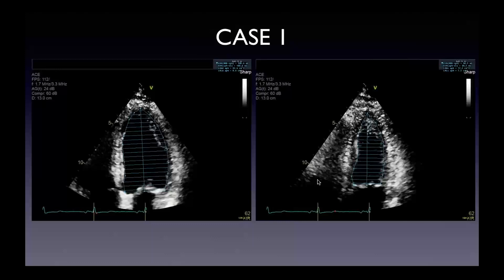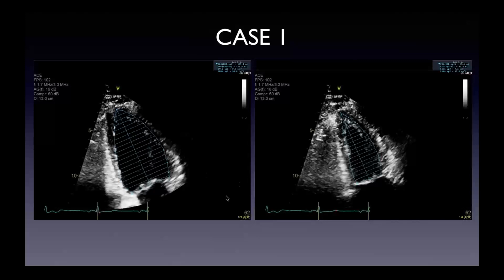Here are my tracings for end-diastole — this is all trabeculations from the beginning, which experience can identify and contrast can confirm. Here's the two-chamber view, end-diastole and end-systole. One of the more common pitfalls in tracings in many labs — both academic and community — is under-tracing of volumes because we're tracing trabeculations, tracing too far into the cavity, or tracing around papillary muscles.